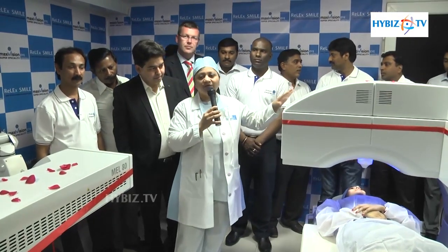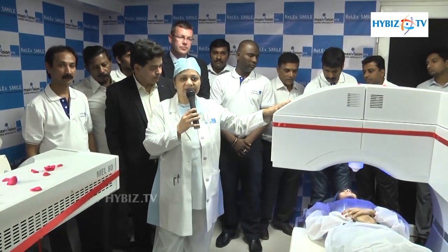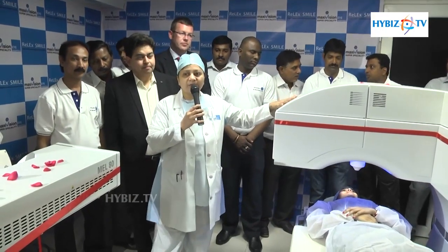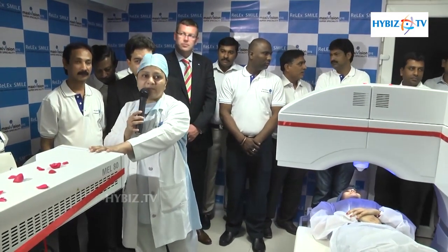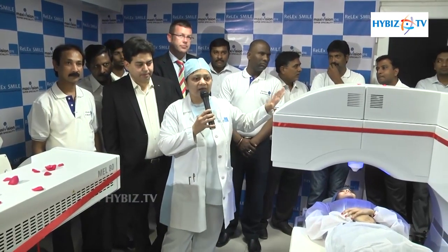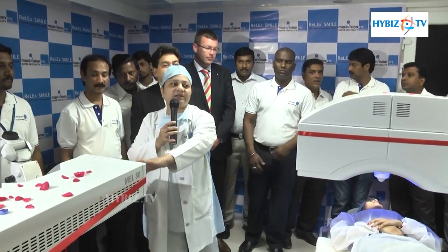Unlike PRK or LASIK — where we have to make a flap — when we do femto-LASIK we make a flap and then correct the power by excimer laser. If we do PRK we don't need this machine. We only need the excimer laser machine where we correct the power by excimer laser.